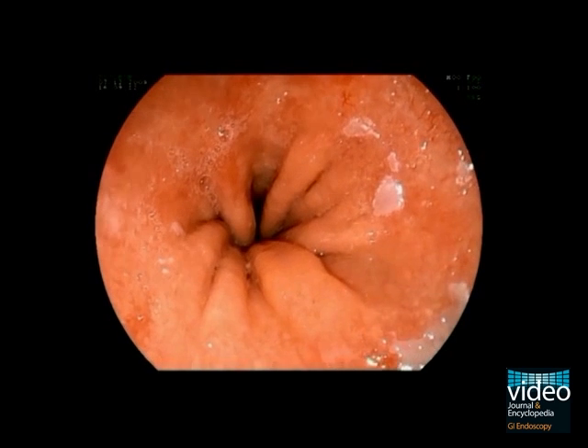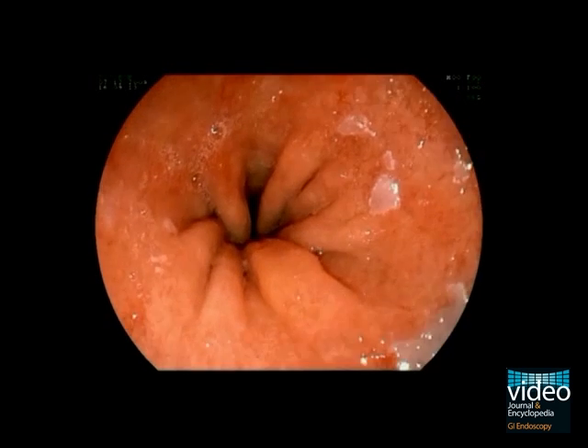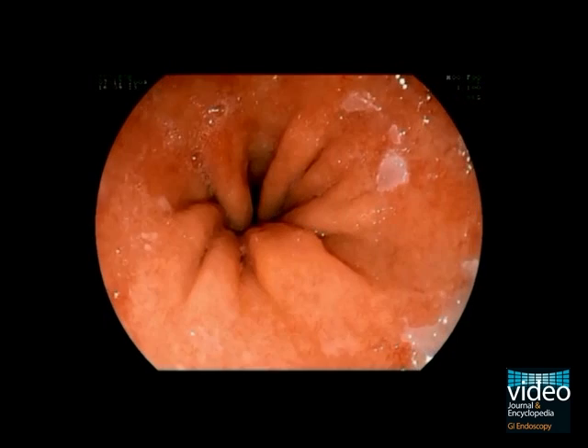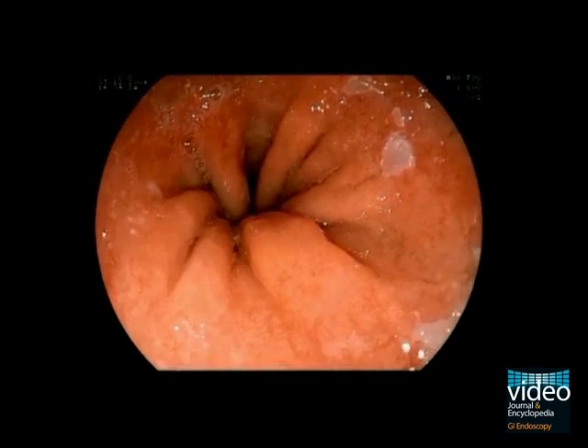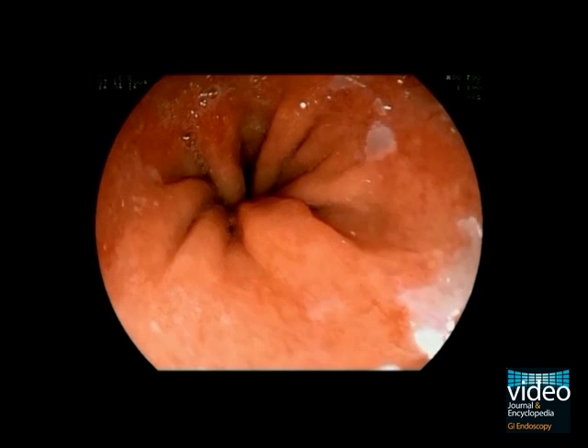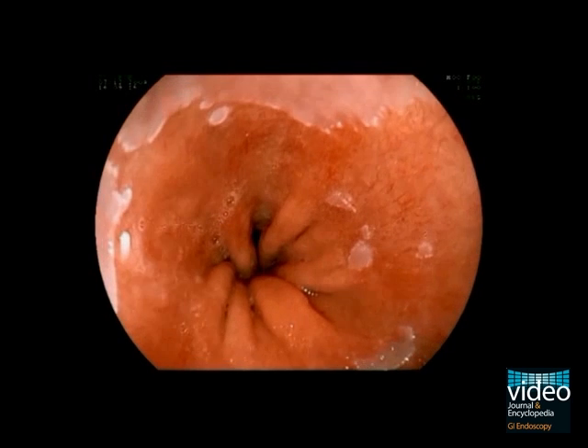The ends of the gastric folds represent the gastroesophageal junction. During retraction, you can see the typical reddish appearance of a Barrett's esophagus. Some squamous epithelium spots are visible within the Barrett segment at the 3 o'clock position.